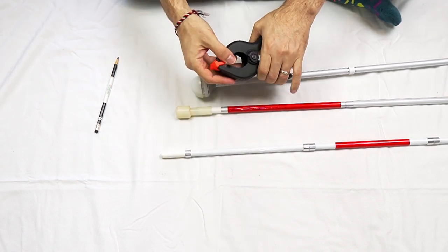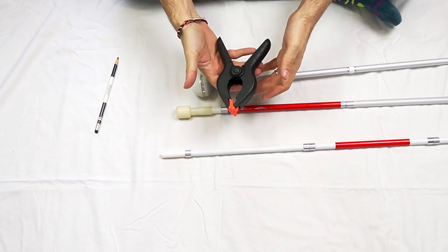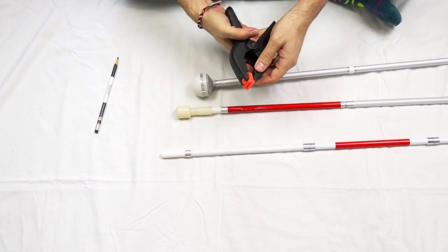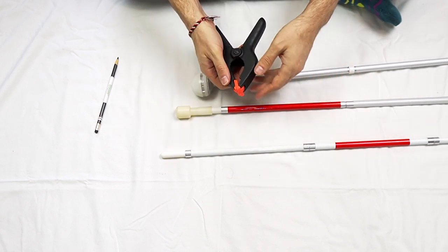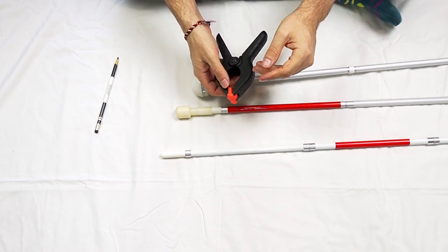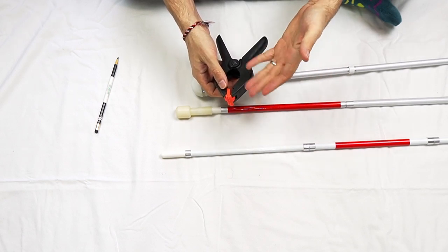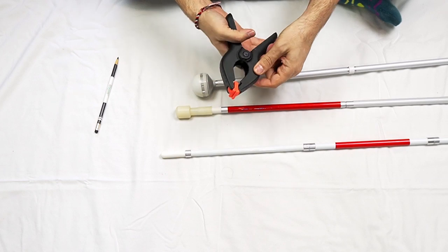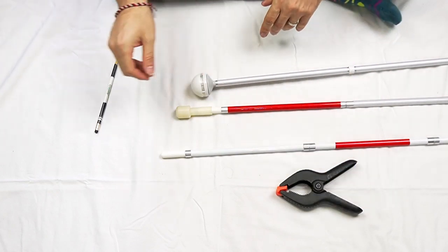One is to use some sort of clamp. This is a shop clamp, super durable. You can find these at hardware stores or big box stores. You could also use a binder for paperwork folders. You can find those at office supply stores. Anything that's going to clamp on it and not let that cord slip back into the cane.